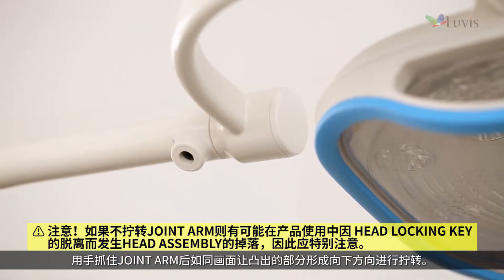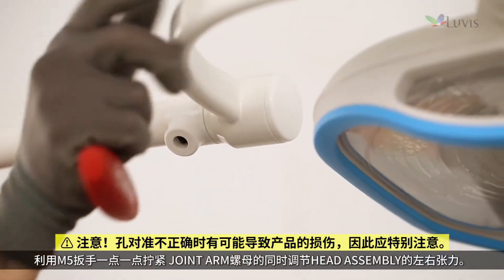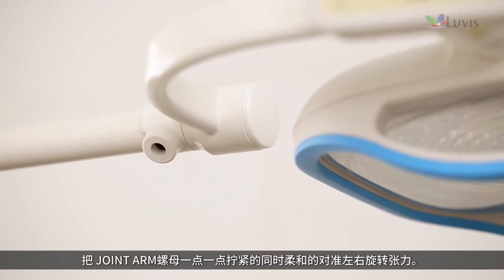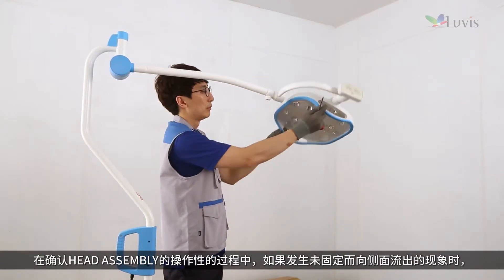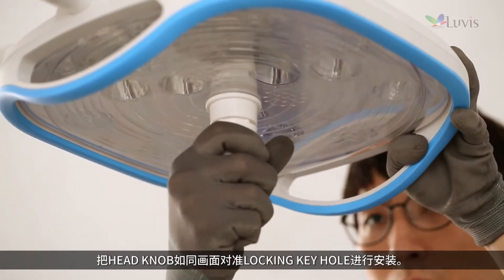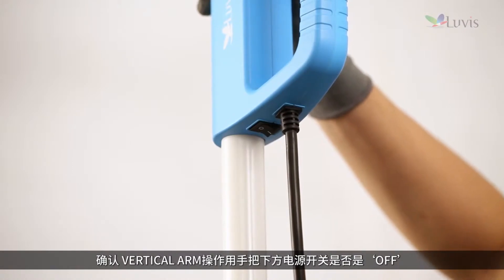Hold the joint arm and rotate the prominent part to face down as shown on screen. Tighten the joint arm bolt gradually with the M5 wrench and adjust the right and left tension of the head assembly. Adjust the rotational tension smoothly while tightening the bolt. If it slips without being fixed, tighten the joint arm bolt using the M3 wrench. Adjust the head knob and install it in the locking keyhole as shown on screen.